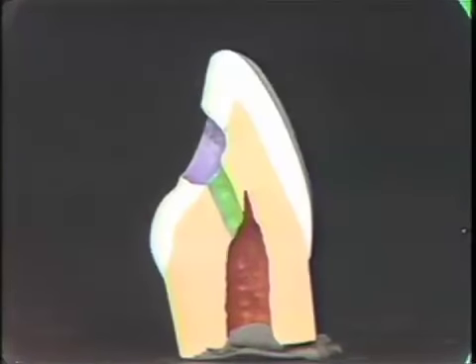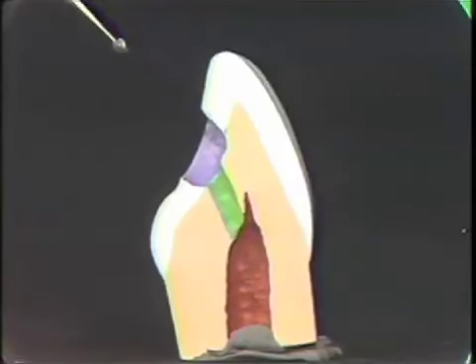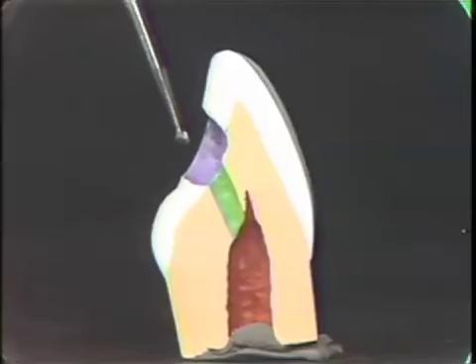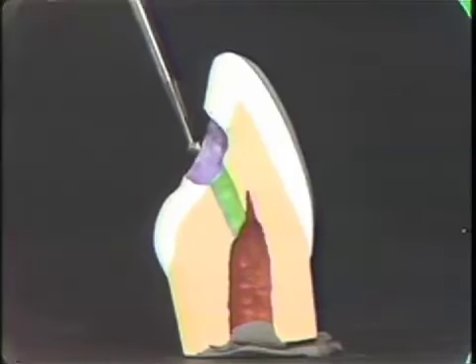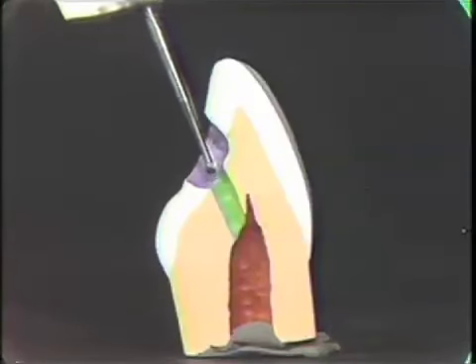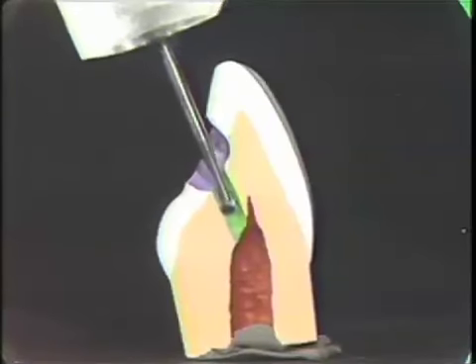The next step is to connect the outline form that you established with your high speed with the pulp chamber. Now in this step, you use the number 4 low-speed round burr in your low-speed handpiece. You change the angulation of the handpiece so it will cut down the long axis of the tooth. You know the pulp is going to be in the center of the tooth, so you want to cut right down the long axis of the tooth. And in one straight shot, you connect the original outline form with the pulp chamber.